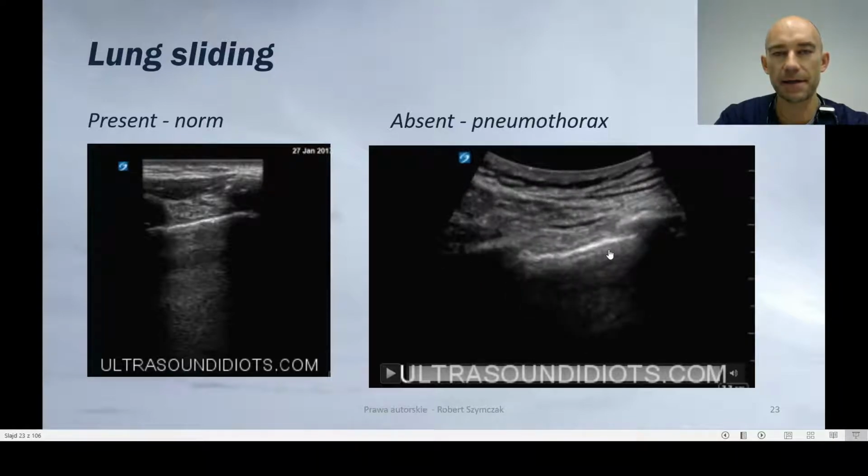And in the trauma patient, we should think about the pneumothorax. And if together with this sign we've got some silence on this side, the trauma is on this side, we should consider pneumothorax. And if the patient is in shock and has a lower conscious level and respiratory problem, that's, let's say, the time you have to decide to perform tube thoracostomy.